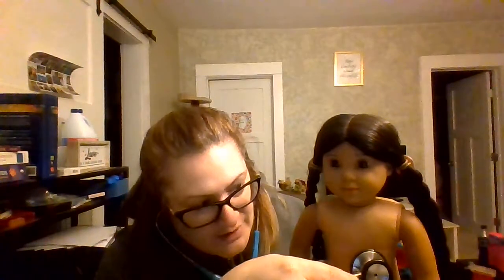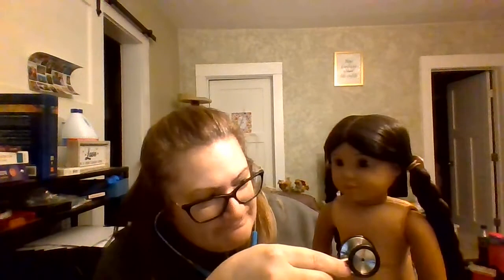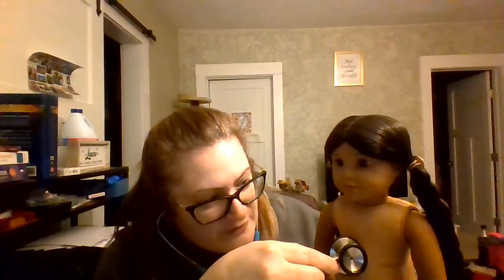Mitral is going to be that apex area. It's going to be mid-clavicle, 4 to 5 intercostal. So I was at 4 to 5. I don't remember exactly where I was, but you want to go over to the mid-clavicle region and listen.